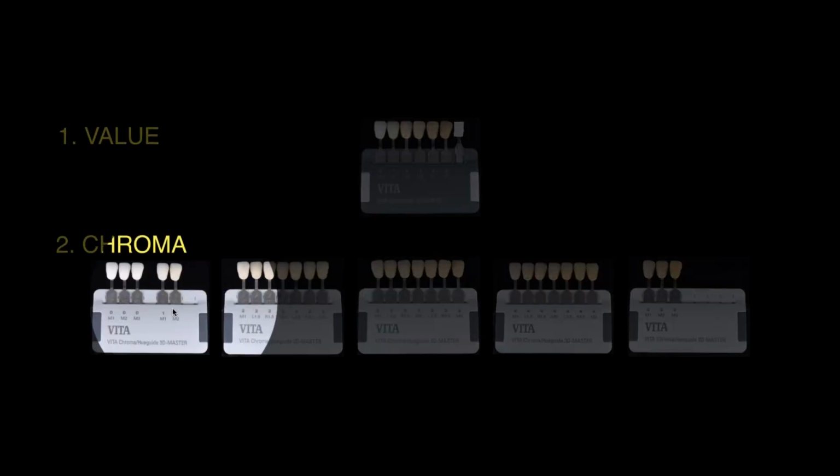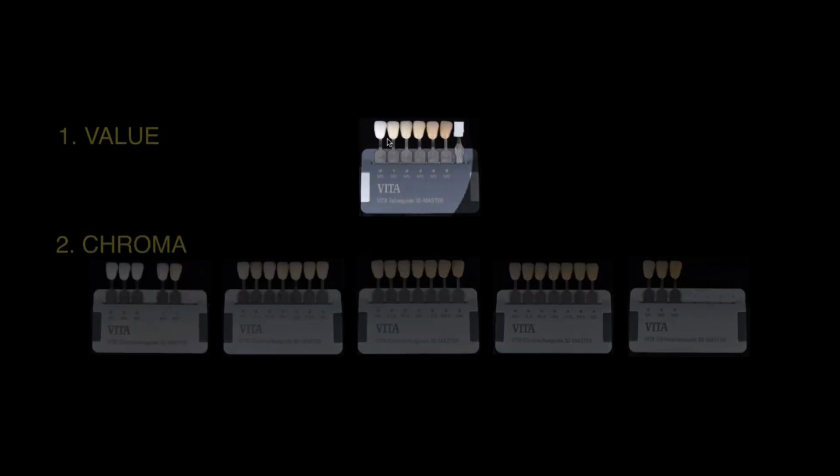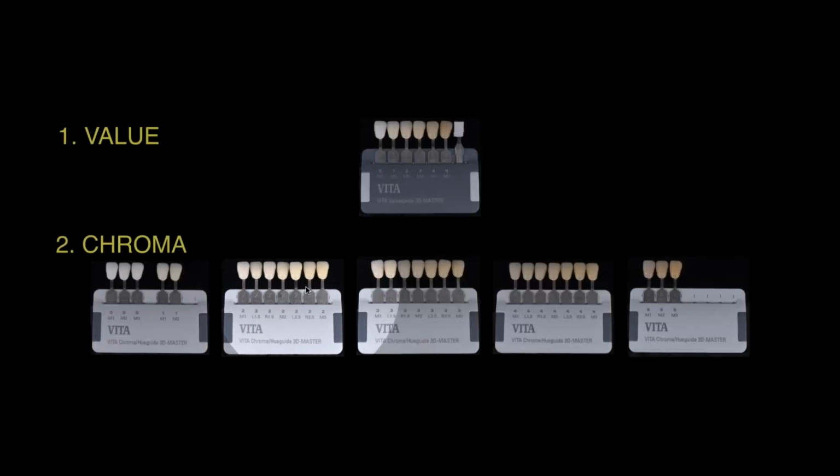Once we know the basic value, then we drop down and look for the basic chromas. Let's say we're taking a 2M2 and the patient's close to the 2M2. Now we move down to the 2s and we say, okay, they're in this range value-wise, but are they more in the L or the R range? To be clear, for most of you who don't know what L and R is, a 2L simply means it's lighter or has more yellow influence. R means it's redder, or I should say lower in value, and has more red influence.